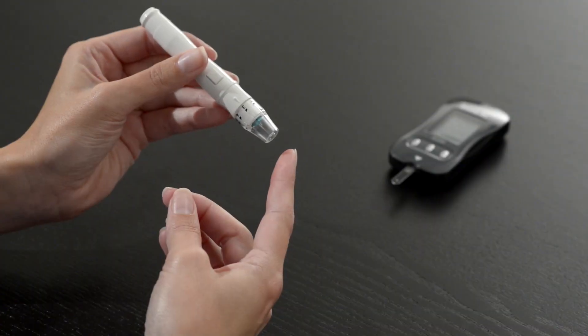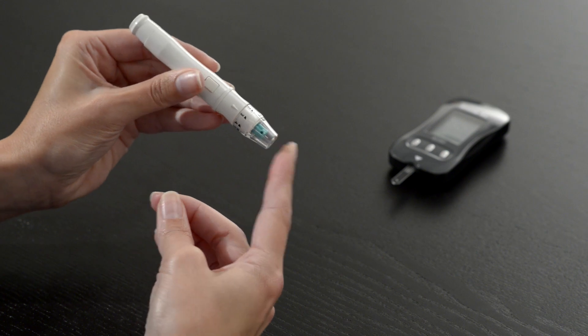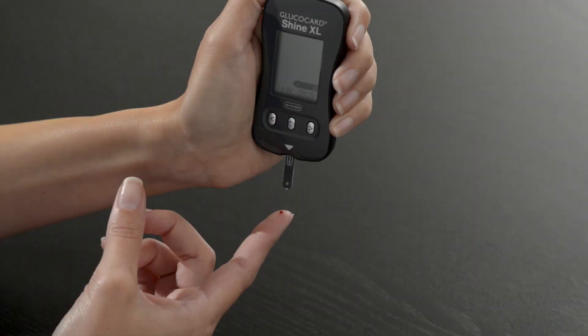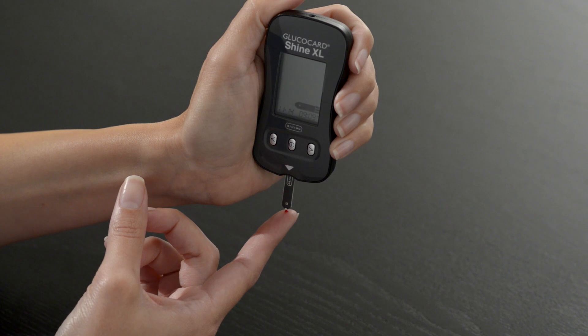Place the lancing device against the side of your finger and press the release button. Wait a few seconds for a blood drop to form. Then apply the blood sample to the narrow end of the test strip until the meter beeps or begins to count down.